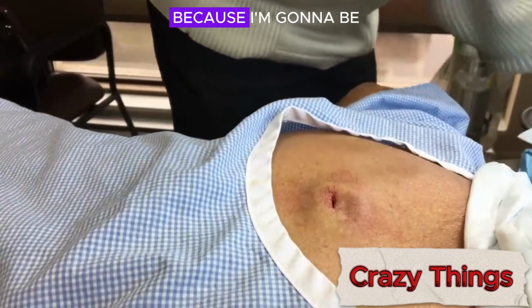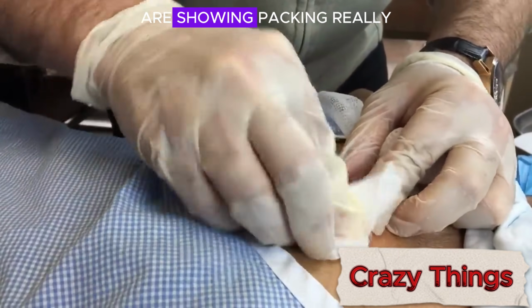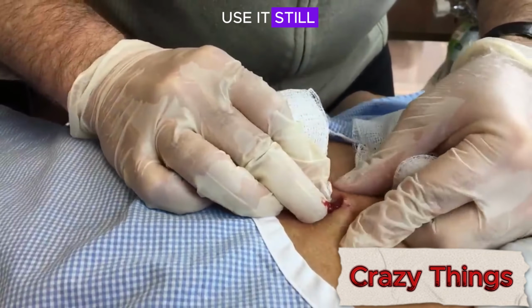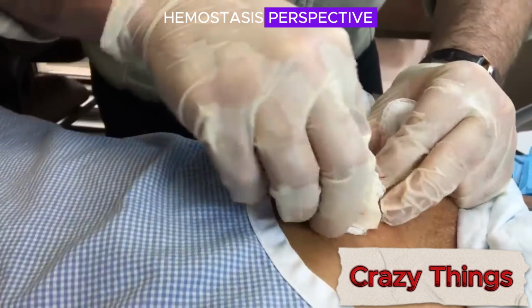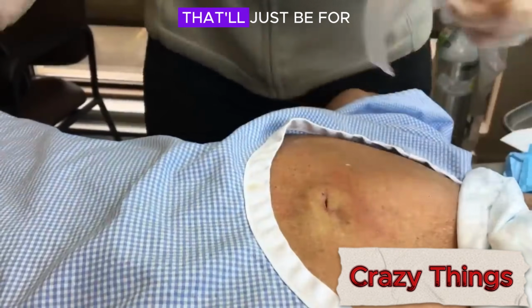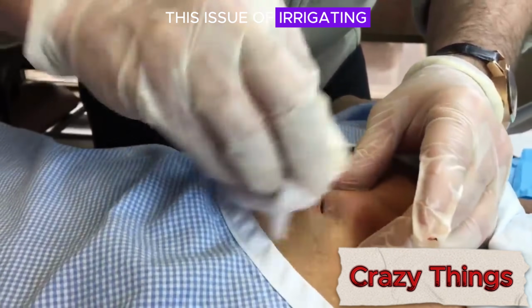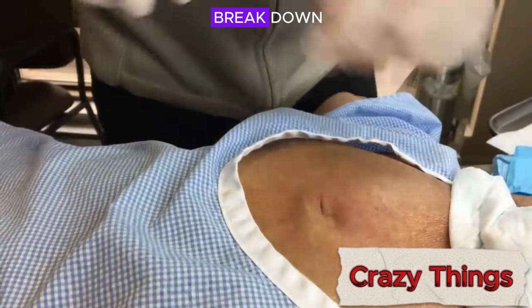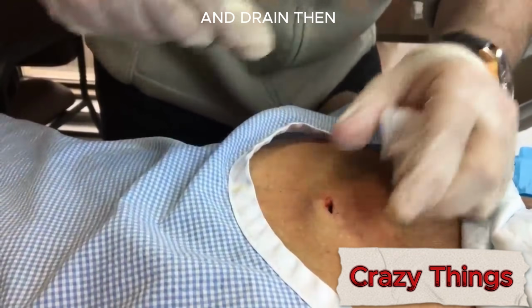And the other part too with this is because we're going to be packing this, and there's an option there as well, because there are some newer studies showing packing really doesn't help healing time at all. But I tend to always use it still, only because I find a lot of these will sometimes still ooze a lot. And from a purely hemostasis perspective, I like to have the packing in. That'll just be for like half a week or so. And the other advantage it creates is with this issue of irrigating it out and getting every last bit out. When you're removing the packing, a lot of times if this is more loculated, those loculated chambers will break down, and when you replace the packing in a day or so, those will collapse completely and drain then.